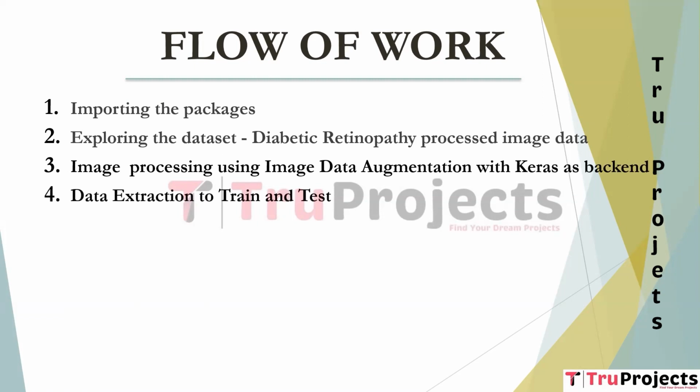Data extraction to train and test. In this step, the dataset is divided into two subsets, which are a training set and a testing set. The training data is used to train the machine learning models, while the testing data is reserved for evaluating their performance. Model building. In this step, we build multiple models, which are Inception V3. It is a deep convolutional network architecture known for its effectiveness in image classification tasks.